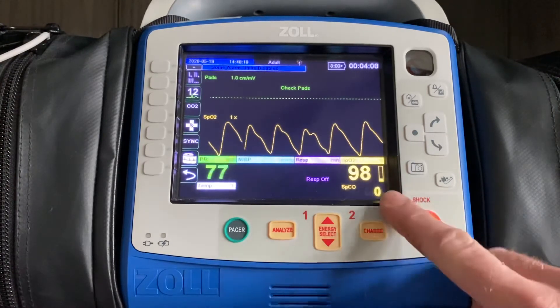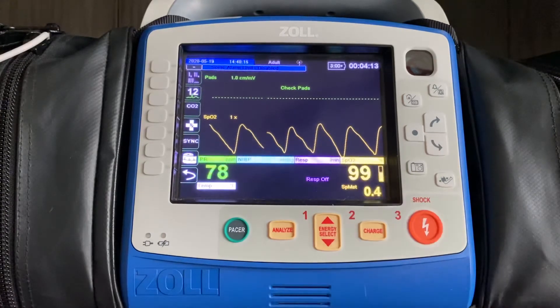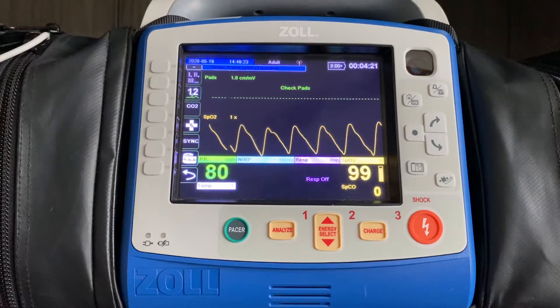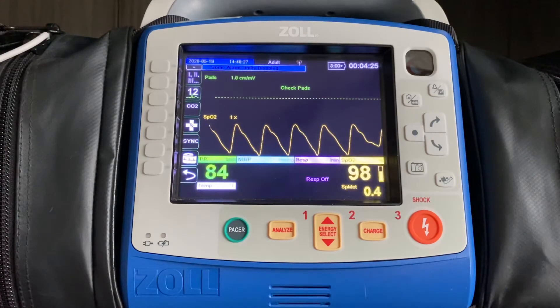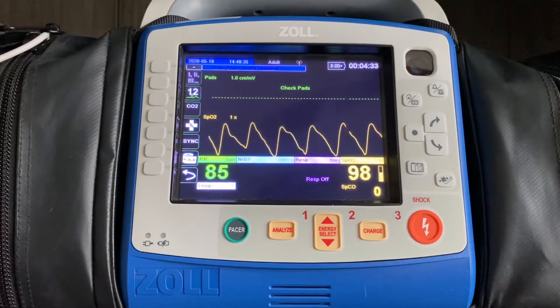The value that says PI, which will be the next number that flashes right here, of 1.6, tells me as the provider that the finger I've chosen to use for this particular patient is perfusing well enough to legitimize the other values being presented while I'm monitoring the patient. The perfusion index, or PI value, should be anywhere from 0.0 to 20. The higher the number, the better that site is perfusing.